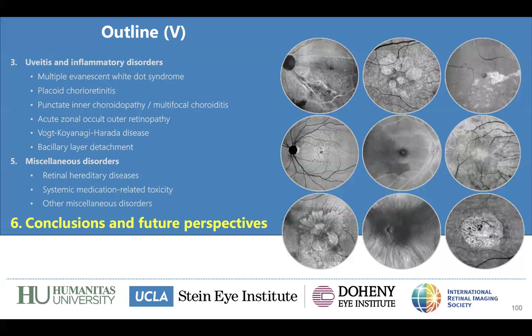I'm curious to learn a little bit more about it, but I don't have that much experience with those OCTs. It's way too expensive so far.